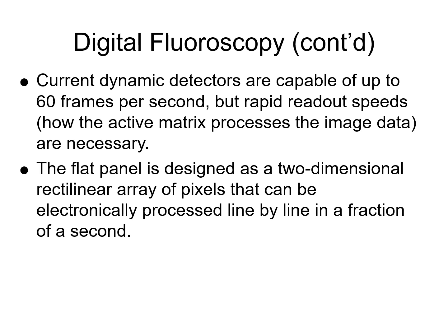Remember, I did mention the CPU, the central processing unit, has a 5 gigahertz clock speed. What does that mean? It's 5 billion computations a second. So our computer brain can read out the pixel array. So let's say in one row of pixels we have, let's make it something ridiculous, 1,000 pixels per row, and then 1,000 columns of pixels too. That's 1,000 by 1,000. What is that? 1,000 by 1,000 is 1,000,000.